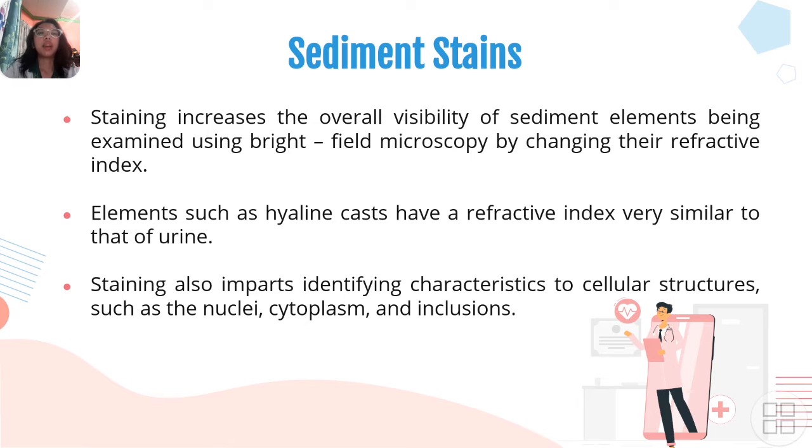Sediment stains. Staining increases the overall visibility of sediment elements being examined using bright field microscopy by changing their refractive index. Elements such as hyaline casts have a refractive index very similar to that of urine. Staining also imparts identifying characteristics to cellular structures such as the nuclei, cytoplasm, and inclusions.